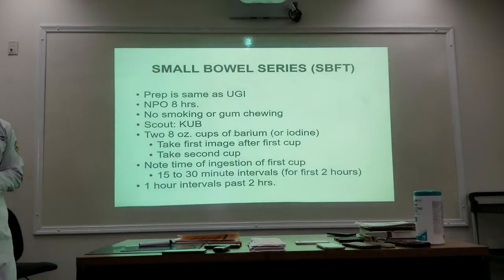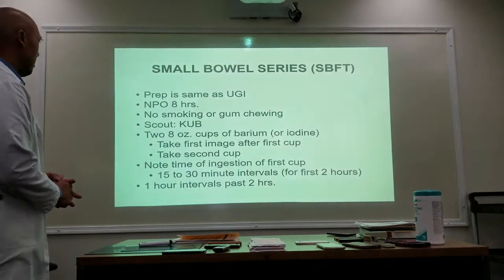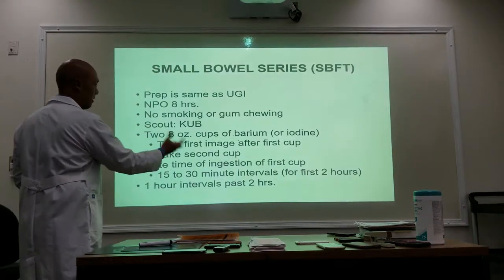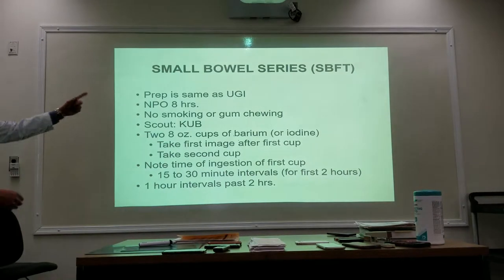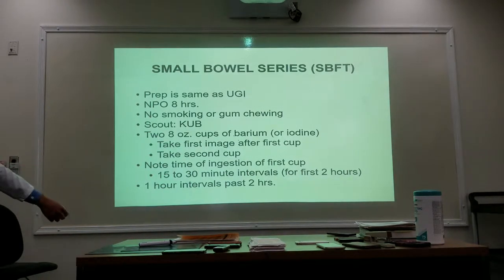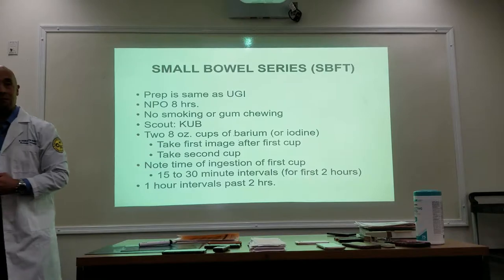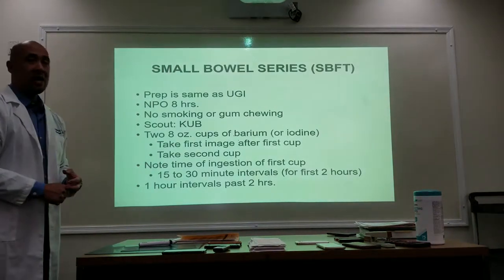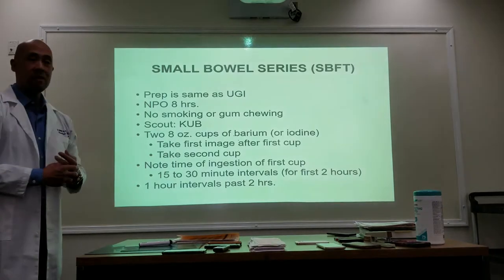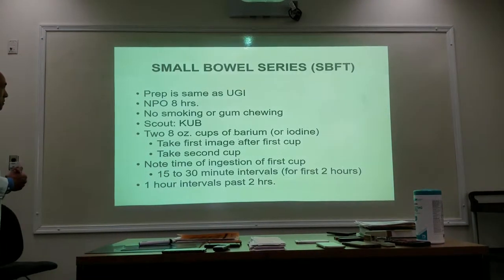So for the small bowel follow-through, the prep is the same as an upper GI. A lot of this stuff is duplicated from other slides, so it's basically the same information. Also want to keep the patient NPO for approximately 8 hours. No smoking, no gum chewing. Okay. The scout is going to be what kind of a KUB? It's going to be a high KUB, so you're going to take a high KUB.